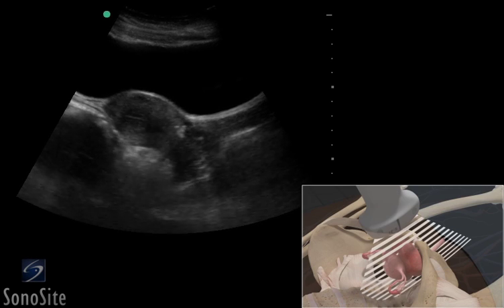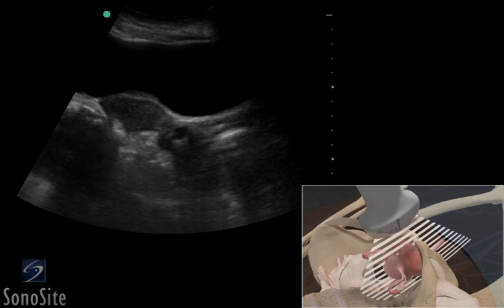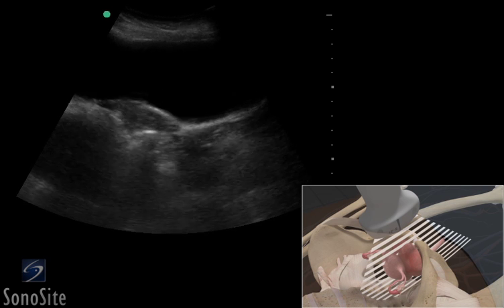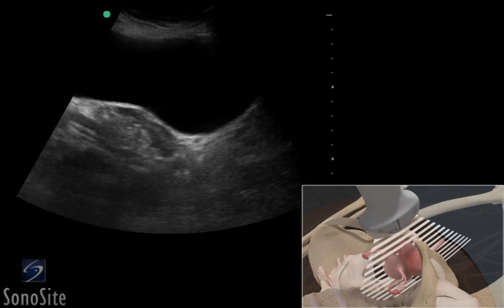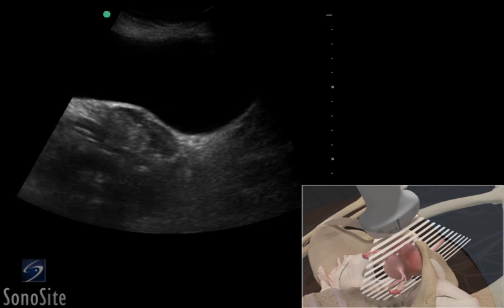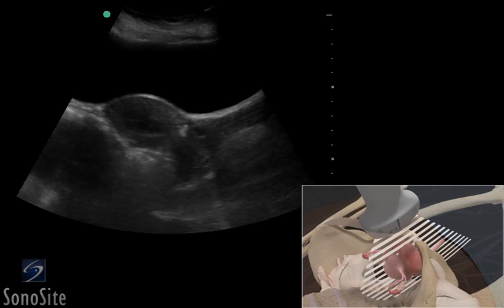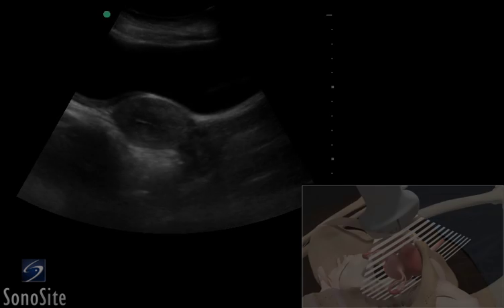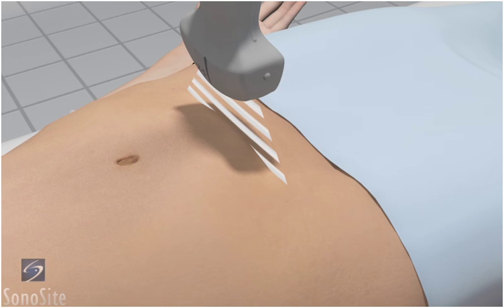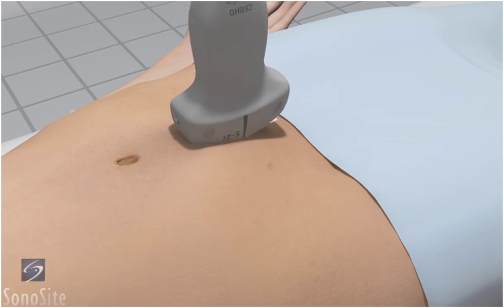A curved or phased array transducer with a pelvis exam type is used to perform the pelvis ultrasound exam. A full bladder is used as an acoustic window to view the pelvic organs. The pelvis is evaluated in two planes. Place the transducer in a long axis position with the orientation marker to the patient's head at the level of the symphysis pubis.